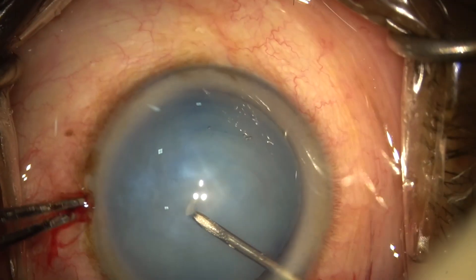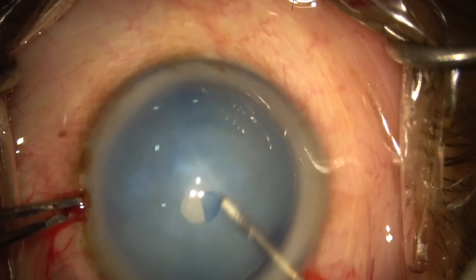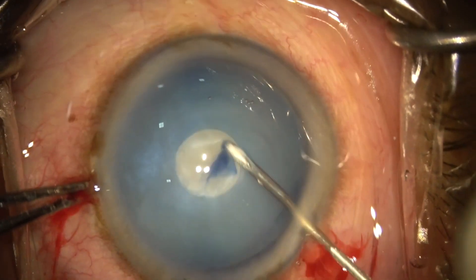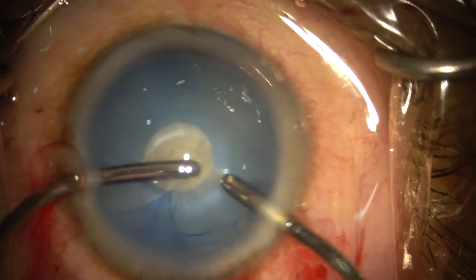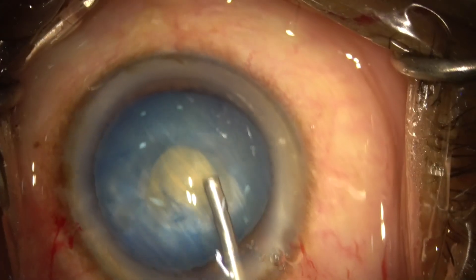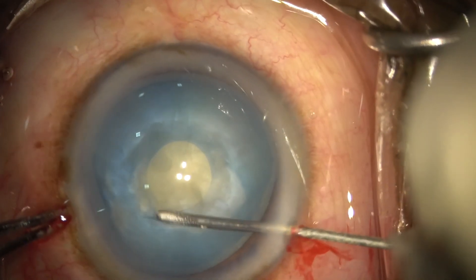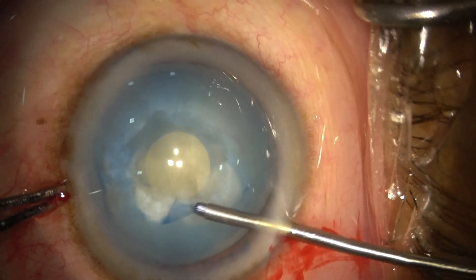This video shows a 3mm rhexis being done using a cystitome. De-bulking of the lens is done using bimanual irrigation and aspiration. The second flap is raised with a cystitome 1mm away from the rhexis border, followed by successful, controlled completion of the rhexis with micro-rhexis forceps.